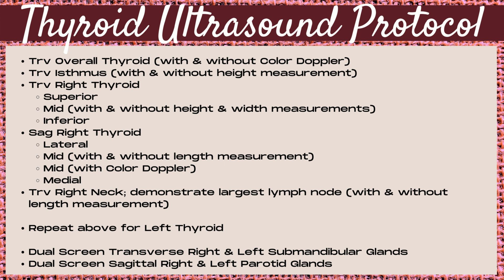Next, move on to the sagittal right thyroid. You want to take sagittal images of the lateral, midsection, and medial portions. For the midsection, take images with and without a length measurement, and also an image with color Doppler.